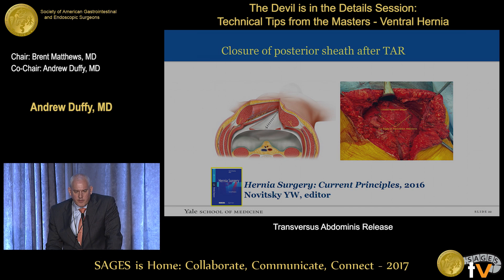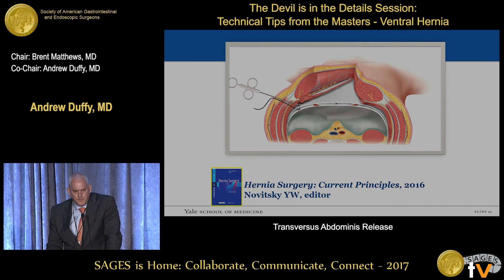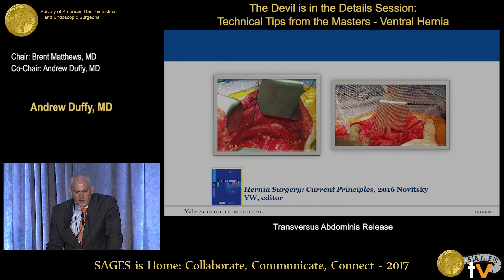The posterior layer can then be closed, usually with a running suture. I like to use a locking suture or tie as I go to maintain tension. When you get below the arcuate line, the tissue gets a lot thinner, and occasionally there are issues getting the posterior layers completely closed. A technique I've used is to use the hernia sac, which I usually excise early, to patch that area, although biologic mesh can also be used. The mesh can then be placed in the sublay position anterior to the now-closed posterior fascia, with lateral anchoring sutures placed transfascially, though I'm moving toward more fixed anchoring points like Cooper's ligament, pubic symphysis, and the xiphoid.